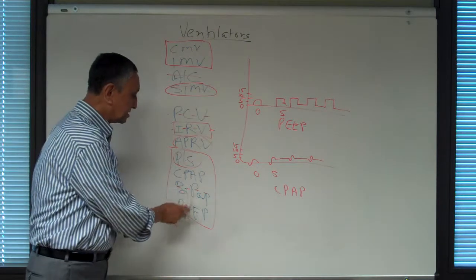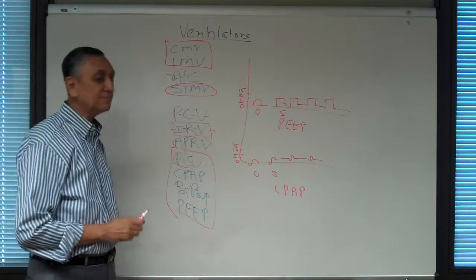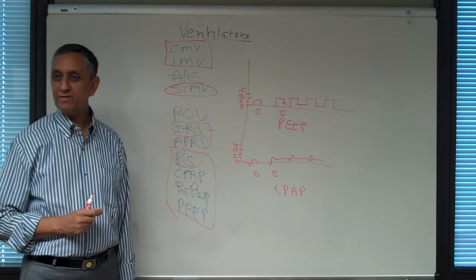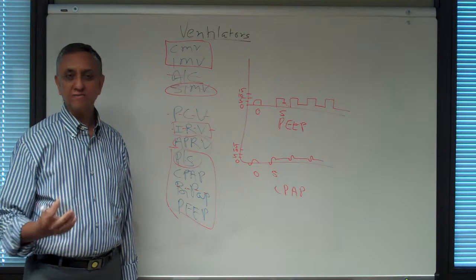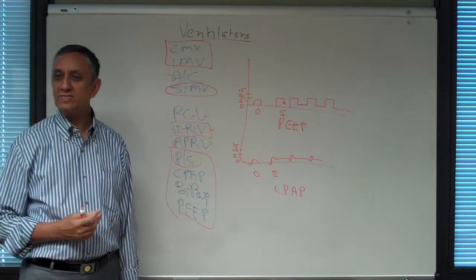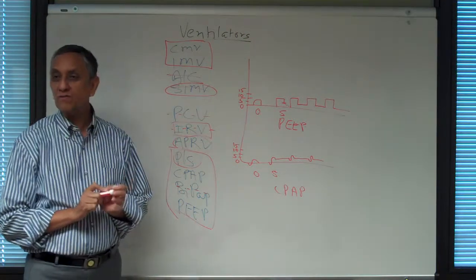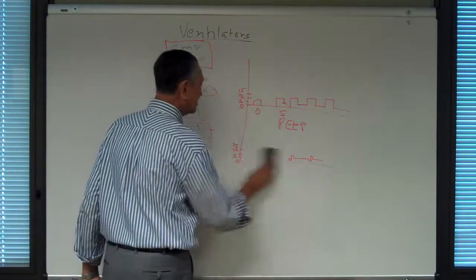Now, is all this clear? Because you seem to be a little bit all over the place. Now, I have my theory of why PEEP is called PEEP. The nomenclatures or the terms that we coin, unfortunately, have no dollar value, so they don't get changed as often. And that gives me an opportunity to keep talking about a misnomer. But I have a theory about where it comes from, and for that, you're going to work with me on this graph.